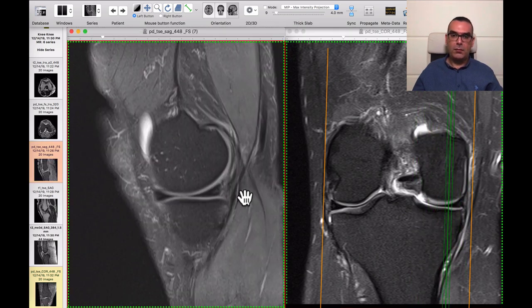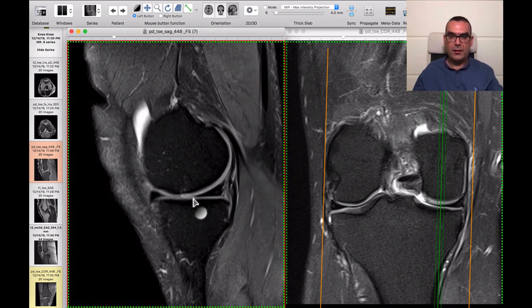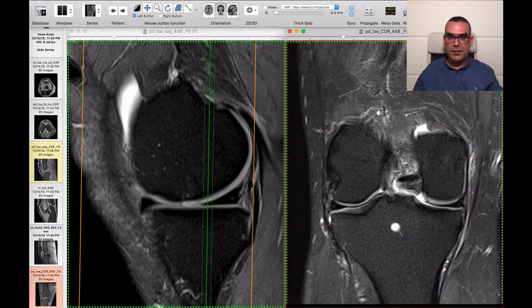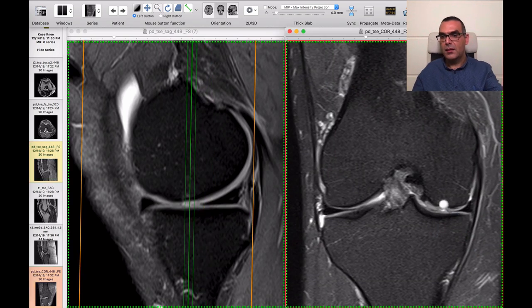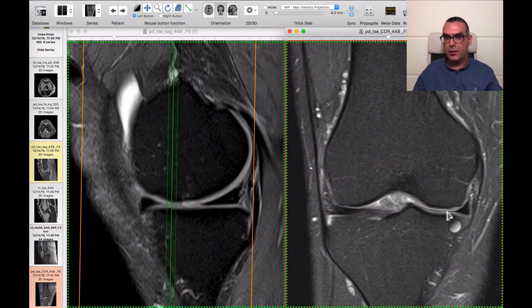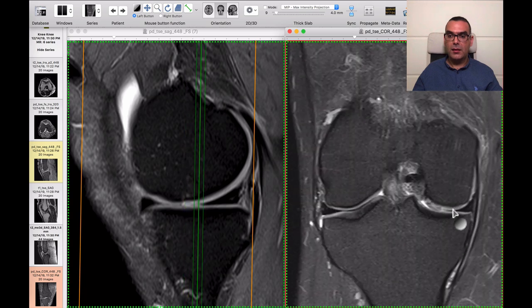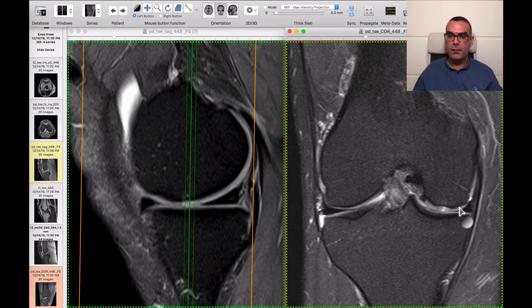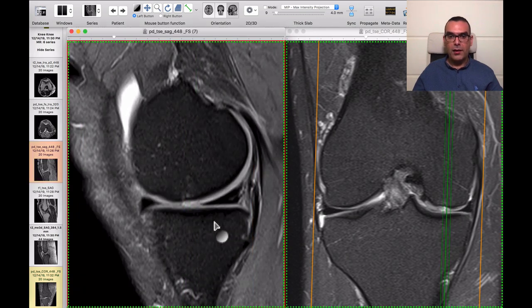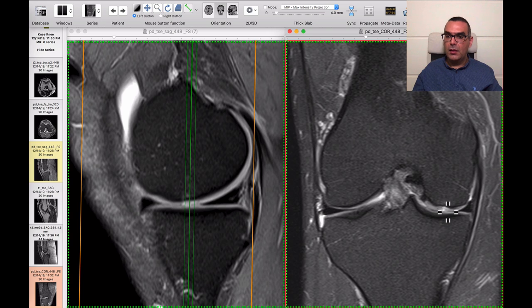Now switching to the sagittal and coronal scans. Starting from the medial side — the posterior horn and anterior horn of the medial meniscus — and there is something at the articular cartilage. There is a focal area of thinning. Yes, there is a small area of grade 3 chondropathy — grade 3 chondromalacia — at the weight-bearing aspect of the medial femoral condyle. It's involving more than 50% of the cartilage girth, but the subchondral bone is intact with no marrow edema. This measures approximately 7 mm in diameter.